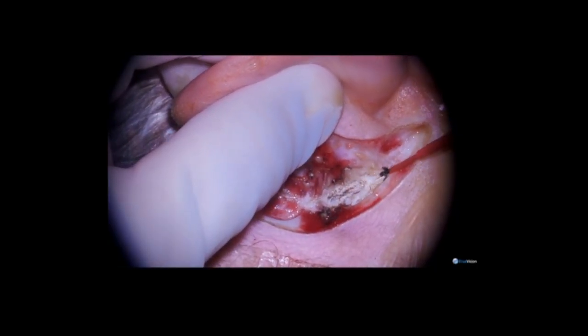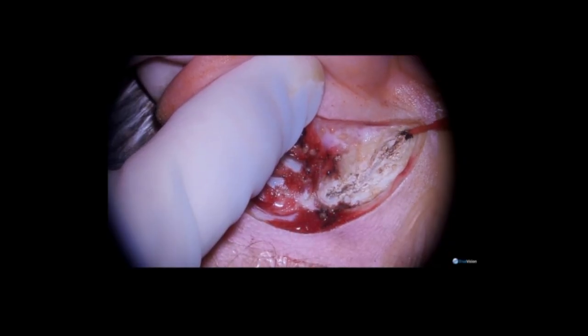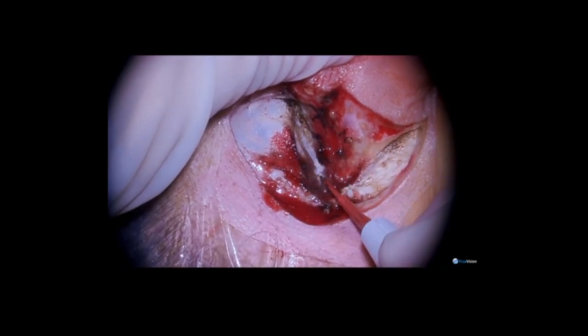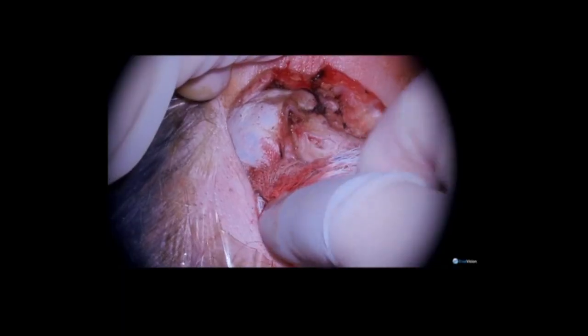I go down straight to bone towards the mastoid tip, and then putting a finger in the ear canal to feel the position, I cut straight down just at the temporal line, and then a little back cut to get good exposure. Using a dry gauze, I elevate the soft tissue to expose the back end of the external auditory canal.